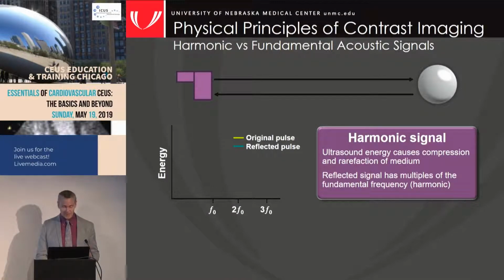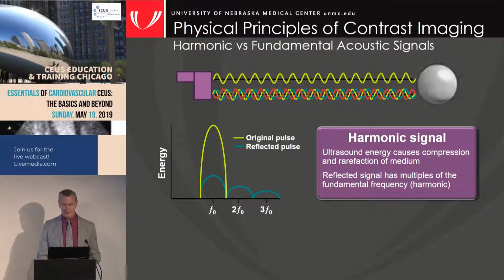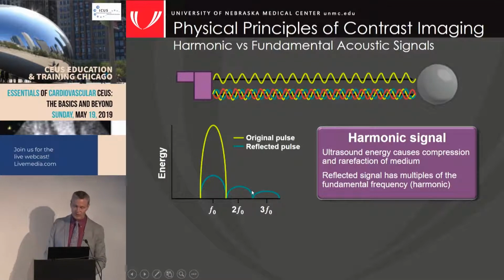Now, as we said, the typical response of a microbubble, as Steve pointed out to you, in response to an ultrasound beam is that it produces harmonic and what we call nonlinear responses. Basically what we mean by nonlinear is that we see these little responses here at the second and third harmonics of the frequency we're transmitting at. For example, if you're transmitting at 1.3 or 1.5 megahertz, you're receiving at 3 megahertz. And the nice thing about that is that's pretty much exclusively from the microbubbles.